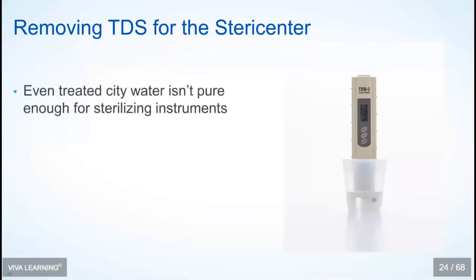So even city water isn't pure enough for sterilizing instruments. We know that. The problem is those totally dissolved solids. And an easy way to think about this is this isn't like the sand and the soil that's in the water. Those are the suspended solids. These are the dissolved solids.